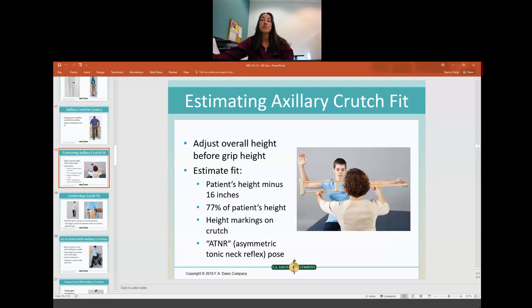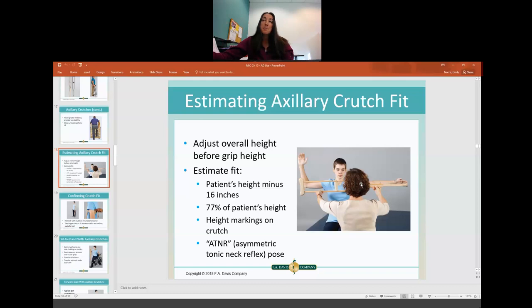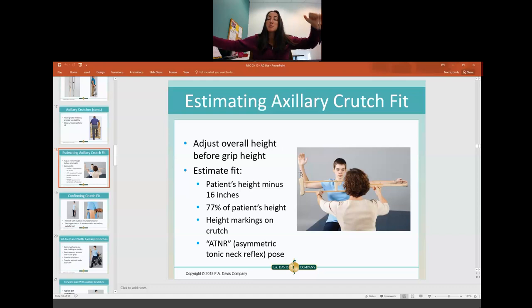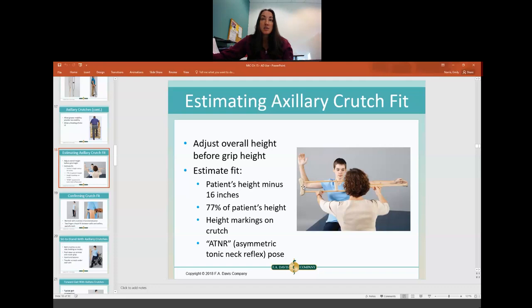To estimate the fit of axillary crutches, you can measure the patient's height and subtract 16 inches, or calculate 77% of the patient's height. You can also use the markings on the crutches. Another method is the ATNR position — ATNR is a reflex where if they straighten one arm and bend the other like a fencing pose, that is typically the correct length for the crutch height. Once you determine the height, stand them up to confirm fit by placing the crutches slightly forward and out to the side.